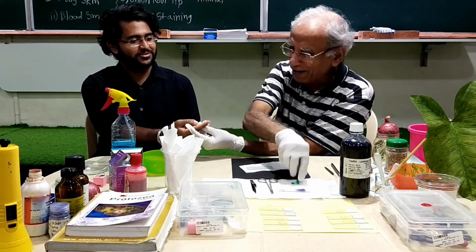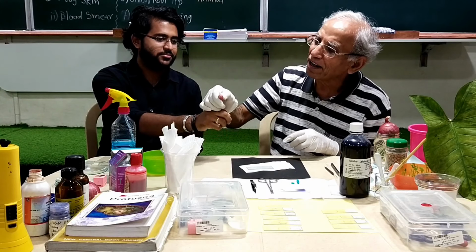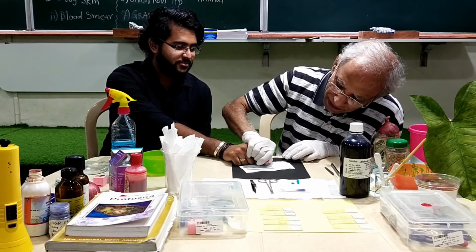Okay, I have pricked his finger and I'm sure some blood is going to come out. See this drop of blood. Oh, it's good. It's enough. Just put some.